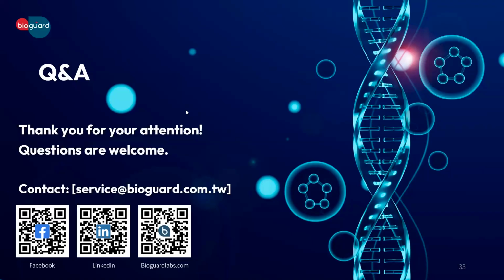So it's very important to clearly identify the location as well as the organs around that fluid. That's why taking off 100% of the fluid could not be done at the same time. It has to be done in intervals, and frequent scanning has to be done, so the inside picture is known. Yeah, thank you.